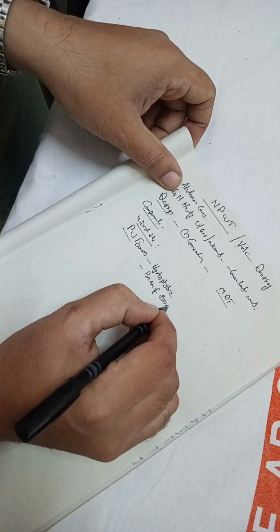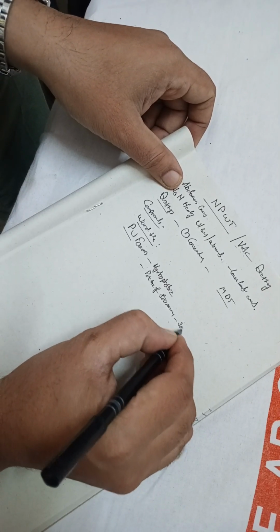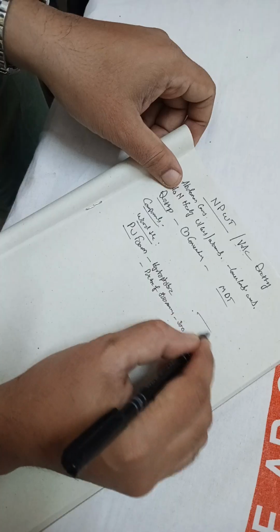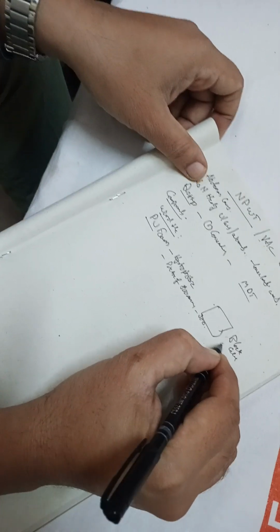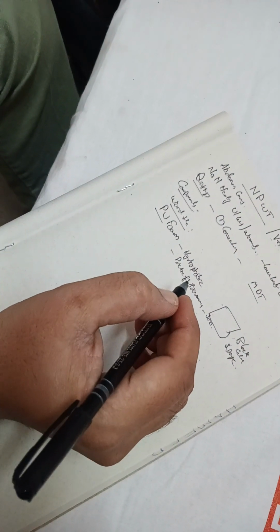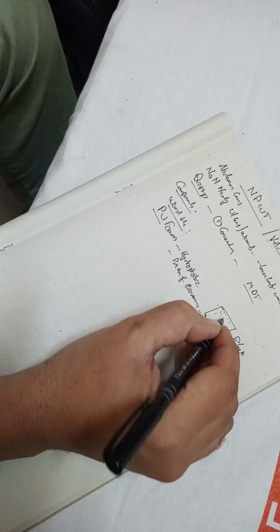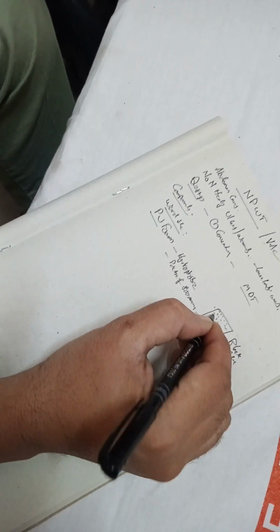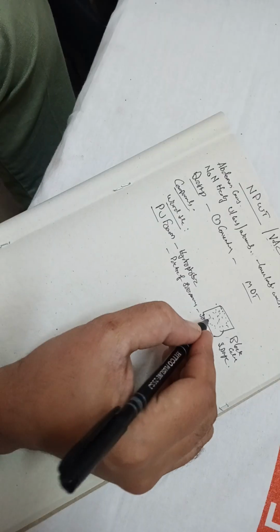It has a pore size of 800 microns. Nowadays it is coming in different sizes, up to 300 also. So it will be a black colored sponge like material. Have you seen that anytime? I'll show you. It will be there. So it will be like a sponge, not a regular sponge like that. It will be black colored. Nowadays white color is also coming, but what is it made up of?